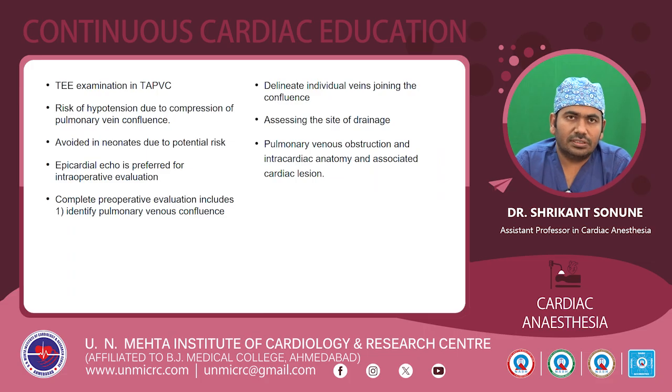TEE examination can be helpful in TAPVC, but there is always a risk of hypotension due to compression of the pulmonary venous confluence. So it is better avoided in neonates due to this potential risk. To overcome this risk, we can use epicardial echo for the intraoperative evaluation.